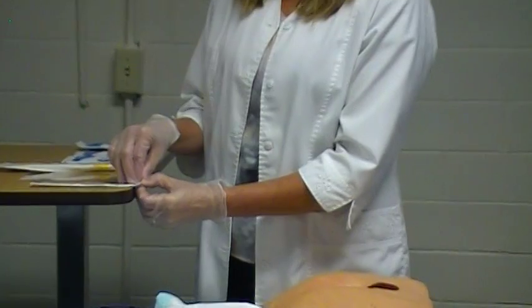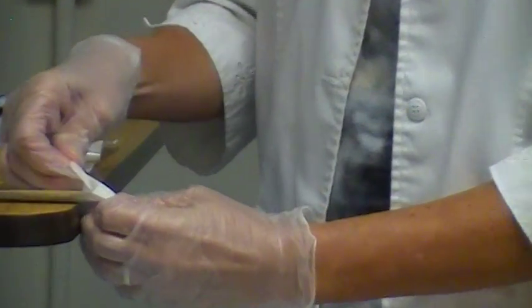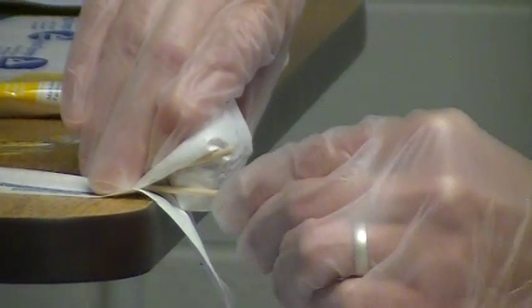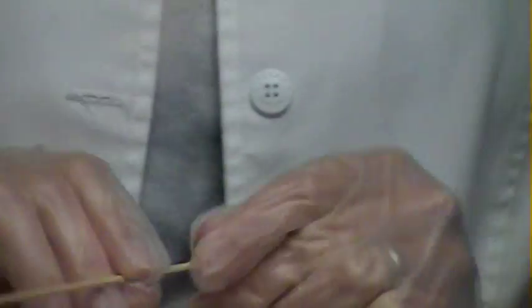Now, you want to make sure that one of these Q-tips stays sterile. So what you'll need to do is try to open this package without touching but only one of the Q-tips, just like I did, okay? Now there's different ways to open that package where you're pulling the one out so that you're not contaminating the other. But if you can do it just like I showed you, that would probably be the easiest way.